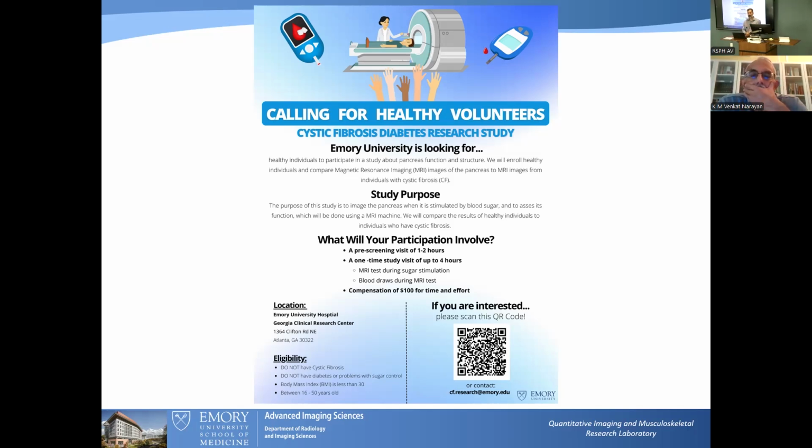Yeah. Are you able to superimpose other modes of imaging on top of the same pancreas? Absolutely. In fact, that was one of the reasons I led with some of the other image contrast that we can produce with MRI, because ultimately, and this is done quite a bit, you really want to have a composite image that gives you fat infiltration, apparent diffusion coefficient, T1, the bold effect, all fused together.